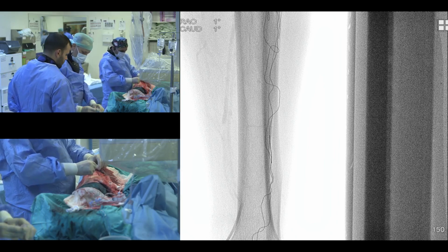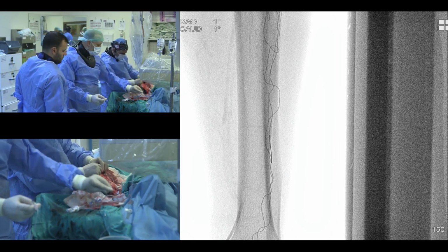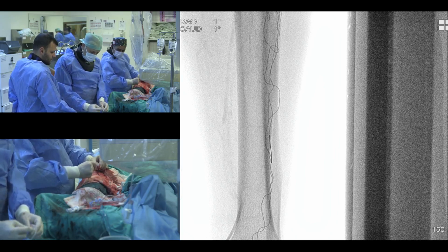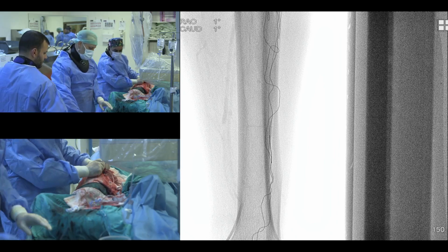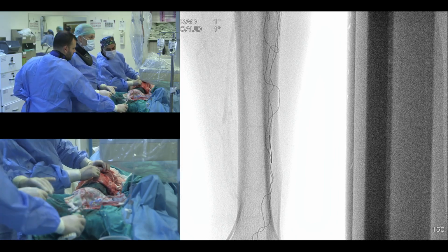Goes home, and this is the result. I'm not going to waste too much time because you have seen enough angiograms. This is the popliteal artery. The TP trunk starts right over here where this is occluded, and this is how the result looks, the TP trunk over here. The anterior tibial comes off somewhere over here, and this is the peroneal ostium. This is the posterior tibial. Only the ostium was involved of these vessels. So I'm very happy. The result is good.